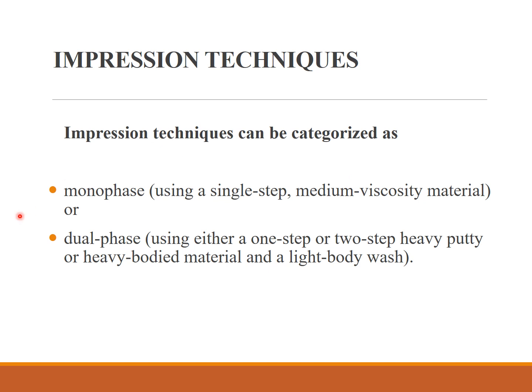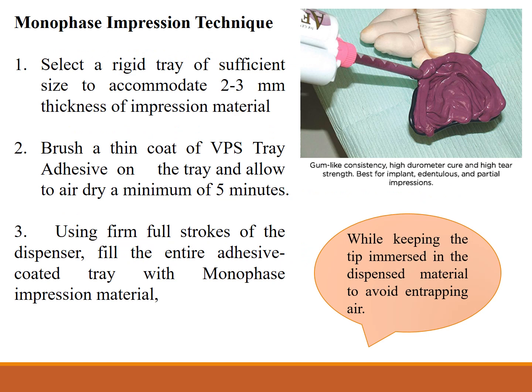Impression techniques can be divided into monophase and dual phase. Monophase is usually a single step, and medium viscosity material is used. Dual phase uses one step or two step, with heavy putty, heavy bodied, and light body wash. Okay, and spaced and non-spaced.